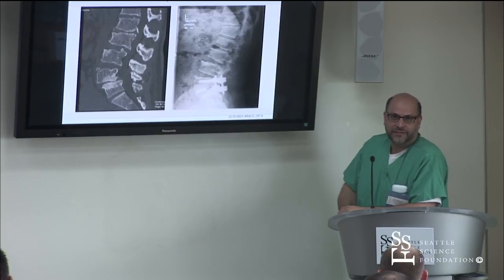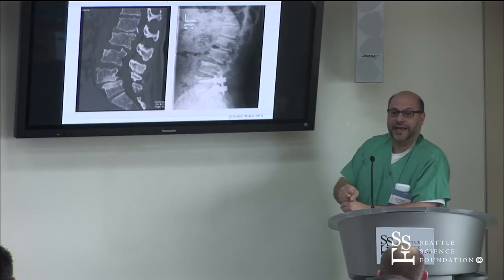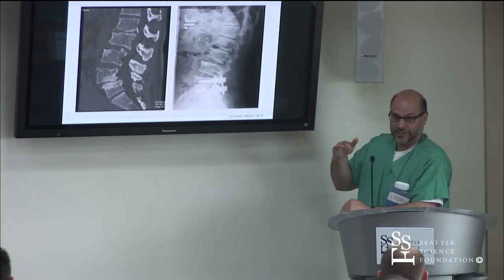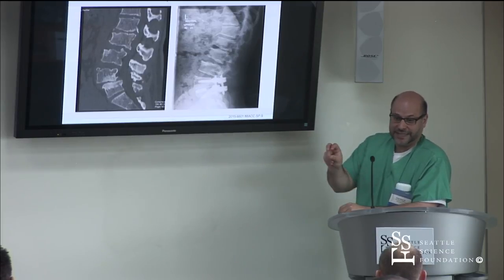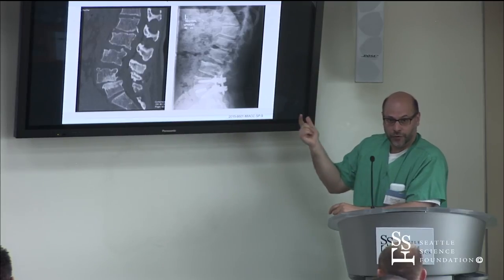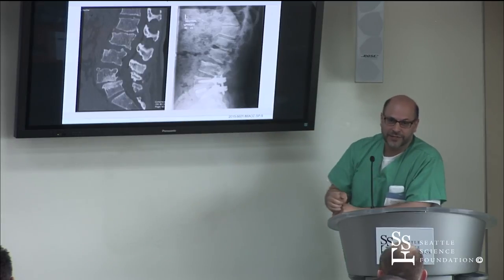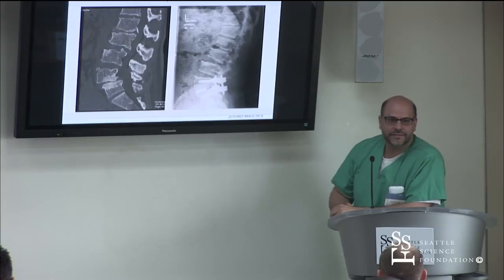And if it were anybody who's spondy like this, deformed like this, where you actually put energy in to jack up and reduce back, that same energy is going to be going against whatever construct you put in, right? So if you just put a standalone ALIF with these little screws or a plate or whatever it is, all the forces are going to be trying to go back to this, right? They're all going to try to go back to forward. So that's a lot of stress. So in my mind, just locking it down.